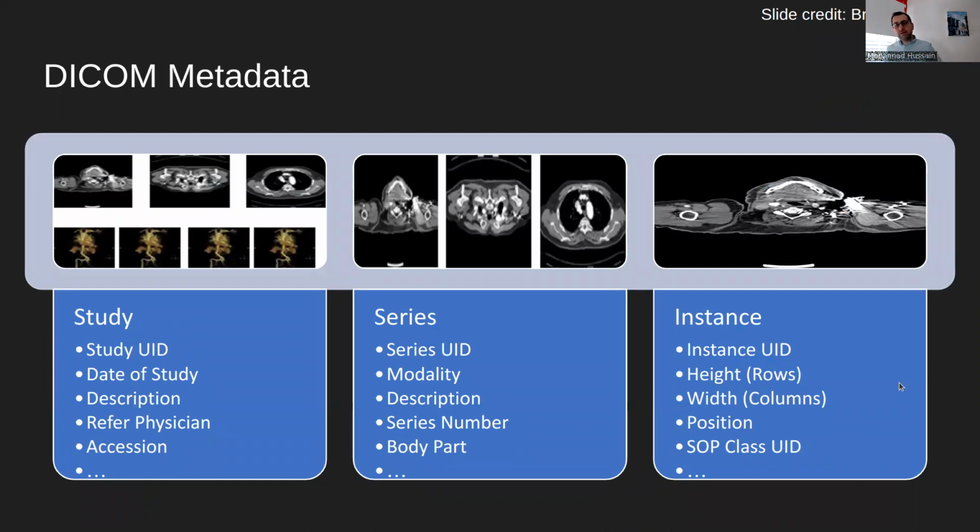At every level in the DICOM, there are a number of metadata elements that are of interest. I don't want to go through these in a lot of detail, but here you get an idea of what they're like. Feel free to go Google each one of these to find out a little bit more about them and what they're used for.